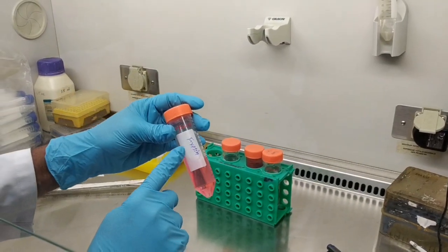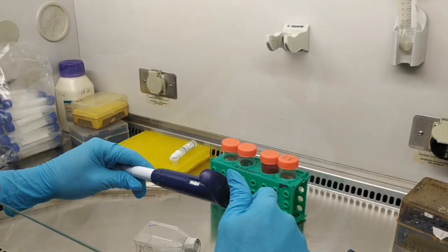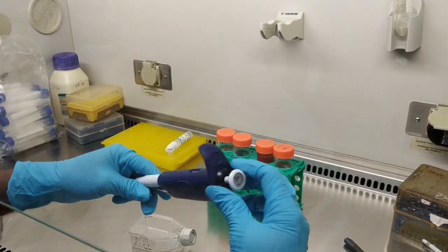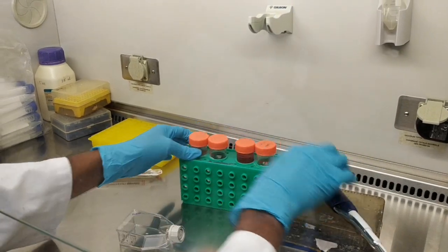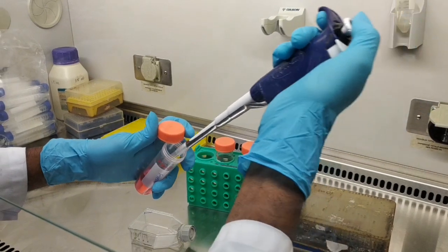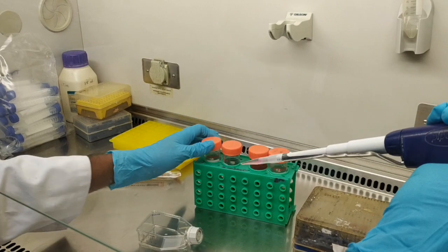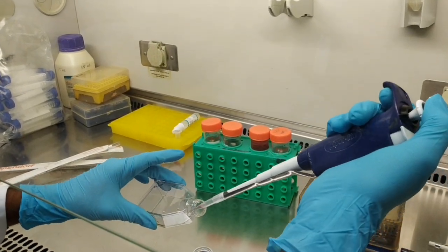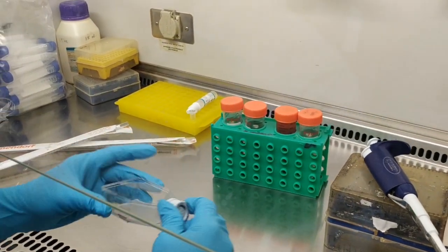And then you need to add the dissociation reagent trypsin to increase the detachment of the cells. You can use a minimal amount of trypsin for the various vessels. For example, for the T25 flask I am using here 500 microliters or less than that. It is sufficient to dissociate all the cells from the T25.